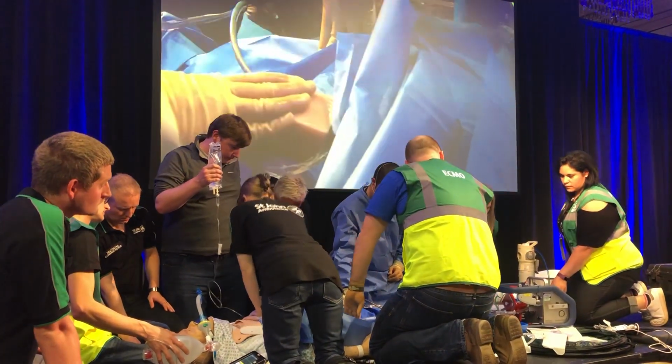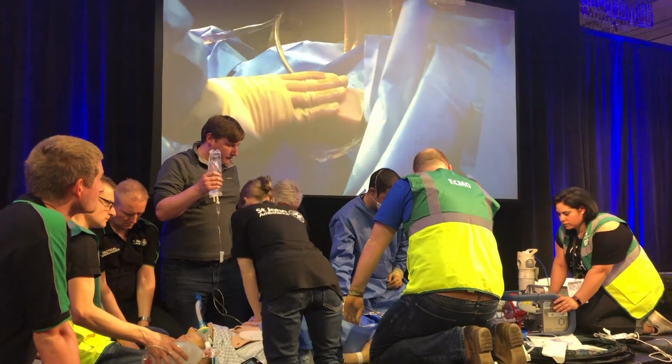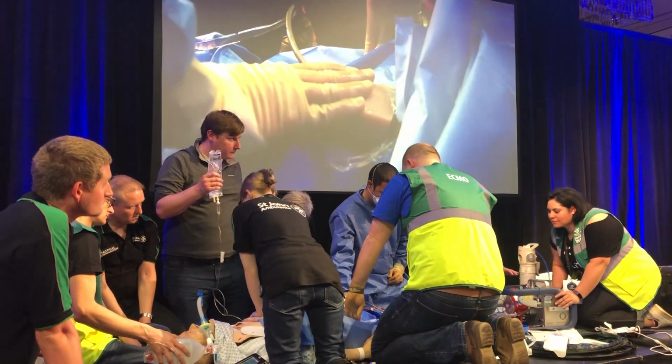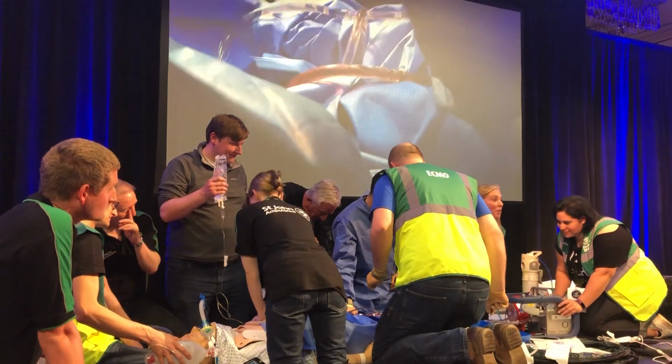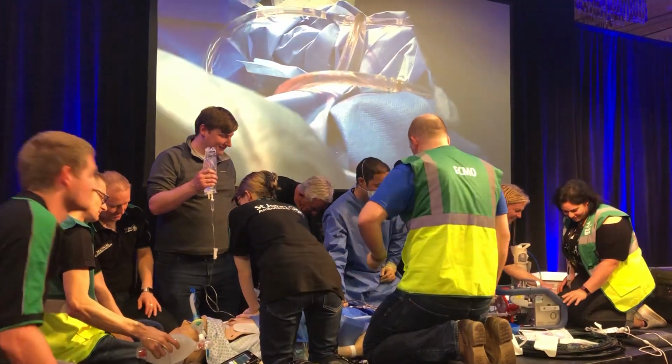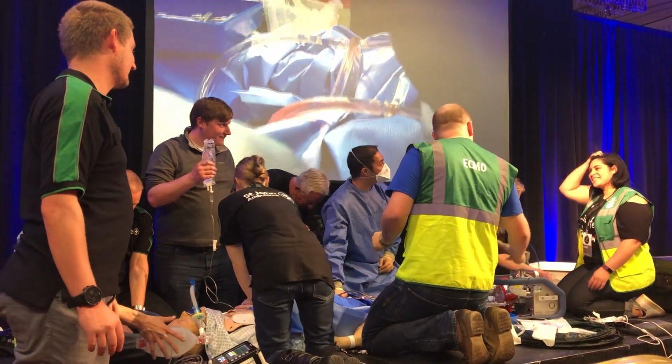We realised that we had just saline that didn't look like blood, so in the last minute you may have seen Mamoon sneak on and inject red wine into the circuit. There's two glasses of red wine to try and give it a red tint.